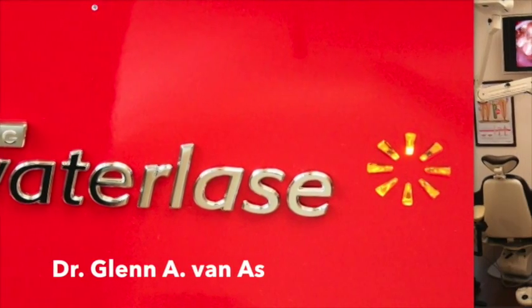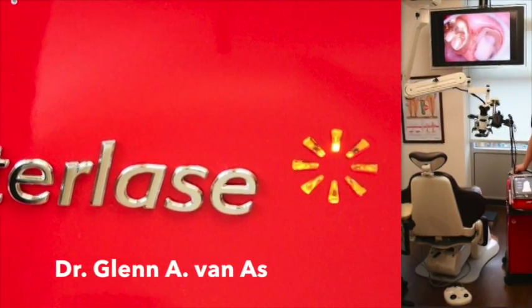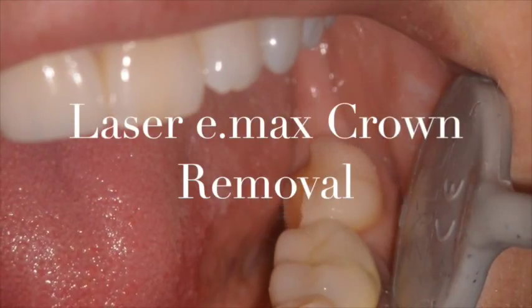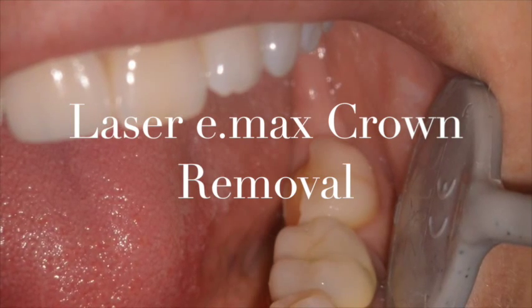Welcome to another edition of Lasering is Amazing with Dr. Glenn Vaness. Today we're going to look at two topics, namely the removal of a fractured Emax crown that you see here, and subsequently laser troughing done with the I-plus.